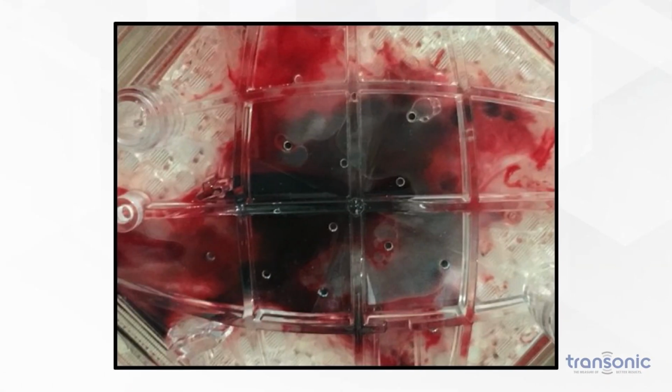Here we have a mountain of clot in the middle of the oxygenator. This is more of a nightmare situation in that you've got so much clot that's growing and shedding and flowing downstream into the patient's arterial cannula, and wide open sections of fiber around this that are not going to transmit any pressure increase upstream from the oxygenator. So other than a small change in color, perhaps in the center, you're not going to have any clue that there's a lot of clot growing.